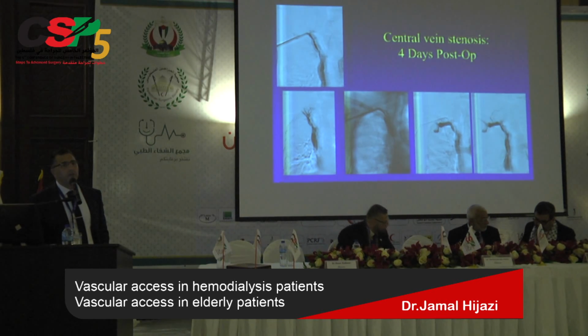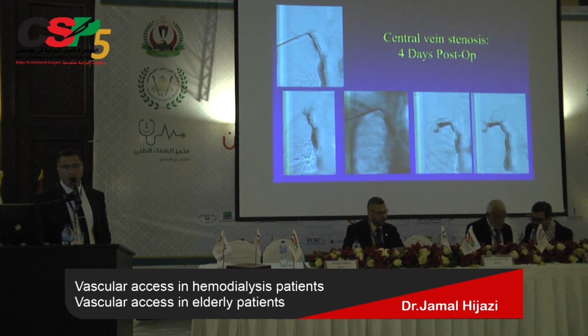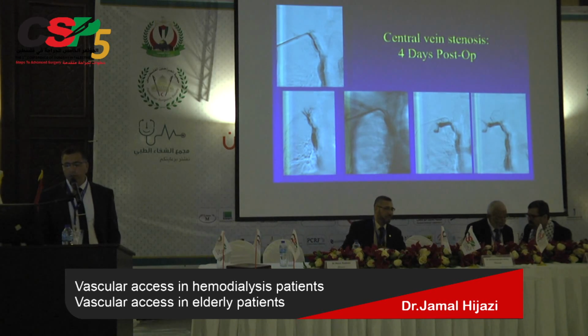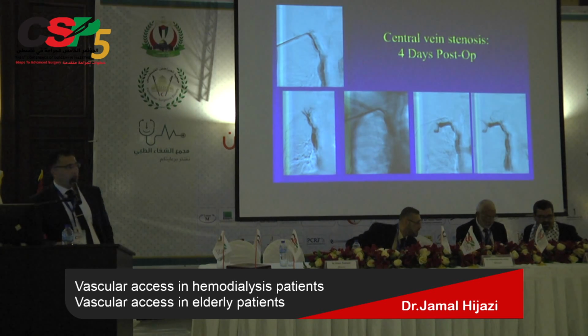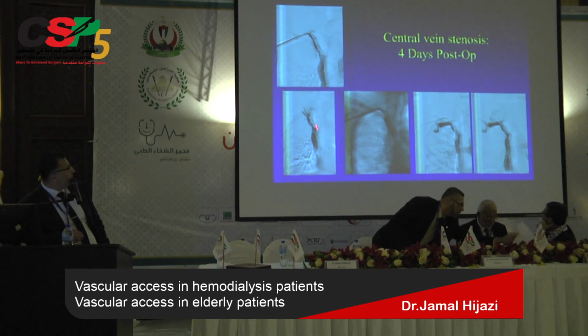When we have high pressure in the fistula, we think that there may be functional stenosis. There's a high flow in the fistula. Sometimes we don't see a mild stenosis, and it becomes more severe with high flow in the fistula. So we did another venography for him, and it showed a severe stenosis in the cephalic vein.